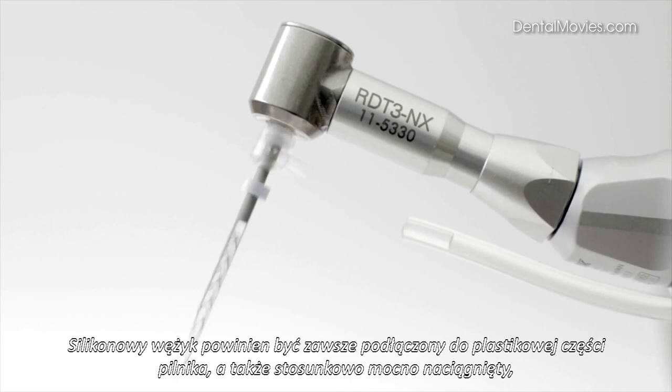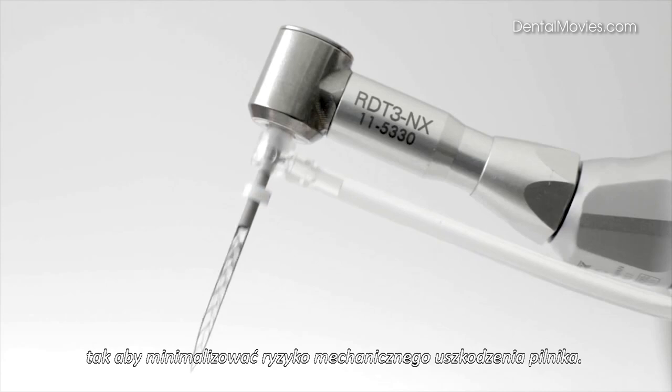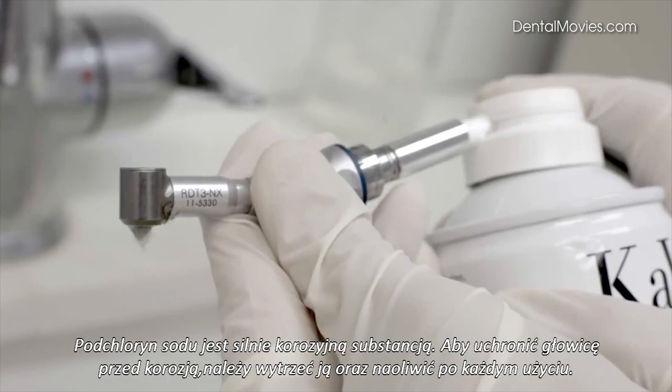The irrigation tube should always be connected to the file and pulled taut. Doing so reduces the rotation speed of the file, minimizing the risk for file separation. Sodium hypochlorite is a potent corrosive. To prevent cumulative corrosion damage, wipe and lubricate the head after each treatment.